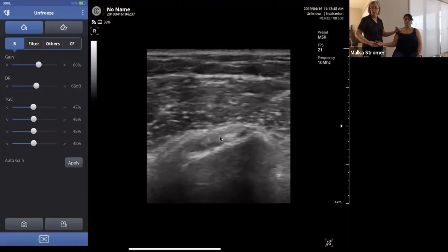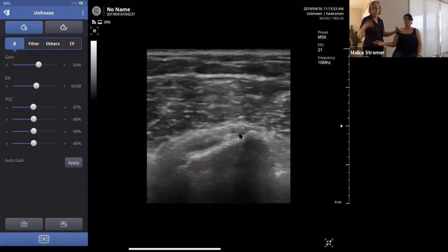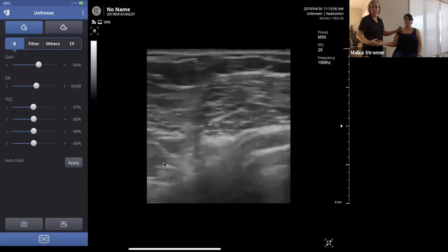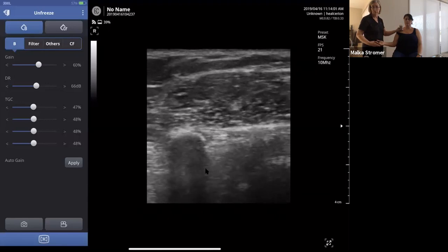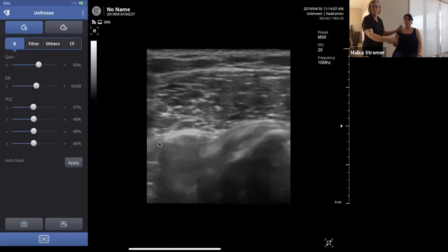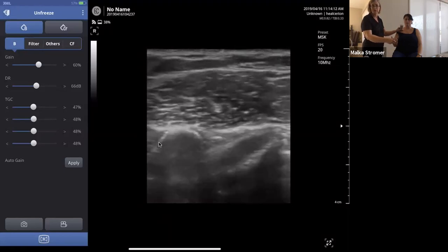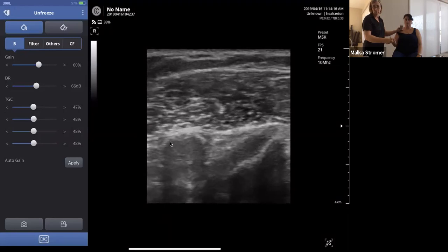The greater tuberosity is to the right. That is the tendon. It has a bird's beak appearance. It looks like a little beak coming down. I'm going to go a little medial and superior. And now we have the coracoid coming in to the left right there. And I'm just going to internally, externally rotate her. Tendon looks good. No impingement through there. Anterior glenohumeral joint is in that space to the lateral side of the coracoid.